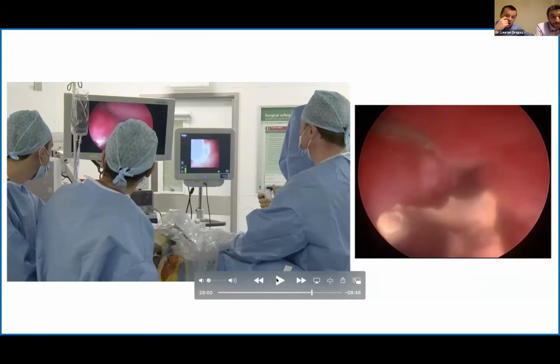Yeah, so I was trying to answer the question before. Honestly, I was not sure what was going to happen, and we've used it obviously many times. We never broke a basket with Trilogy, and in some of the images and parts of the video, you can see that the Trilogy works in between the wires with the basket there. So I think it might be less risky compared to when you try to laser the stone in the basket. I was fully aware of that because I didn't know what it would do.